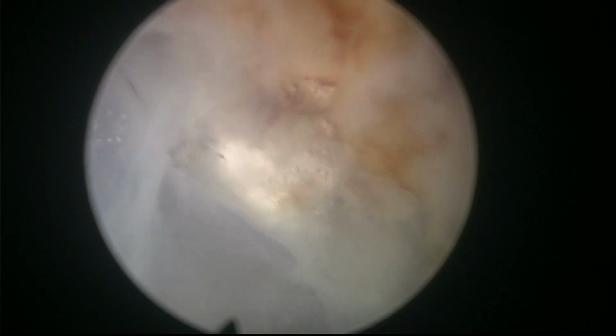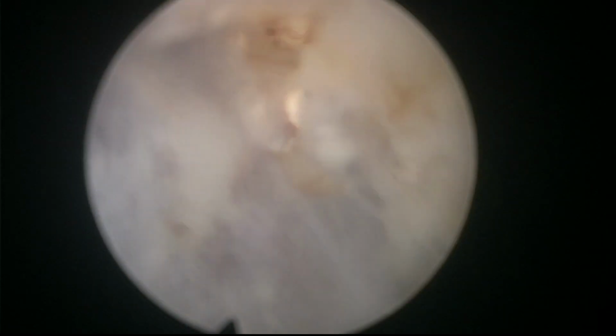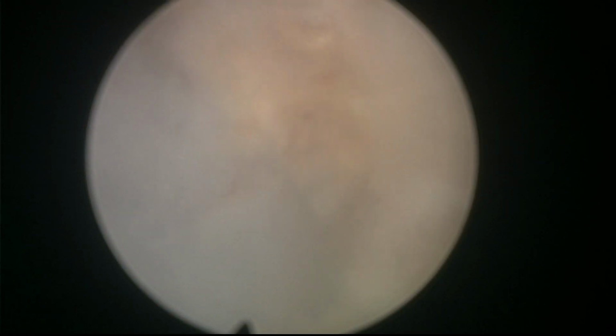This thins the capsule a little bit, but see here's where we want to be. I remember when we did open surgery, at the end of the enucleation with the finger, you would put your finger in the fossa again to check for nodules. So these are these nodules. Okay, so here we are. It's virtually nothing, but yeah, almost there, almost there.